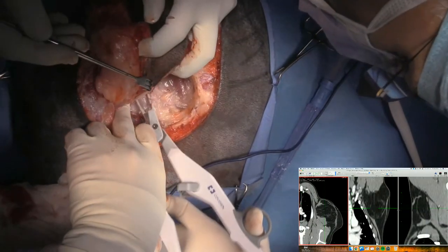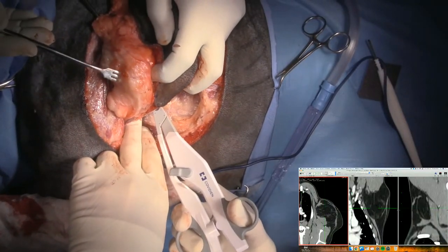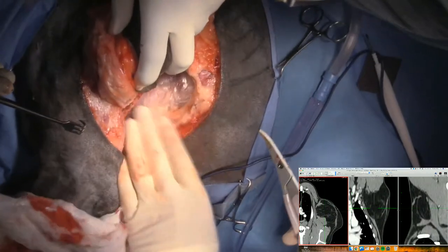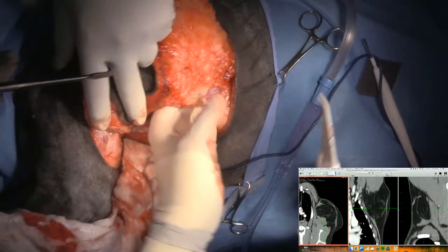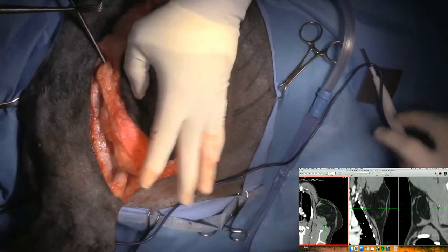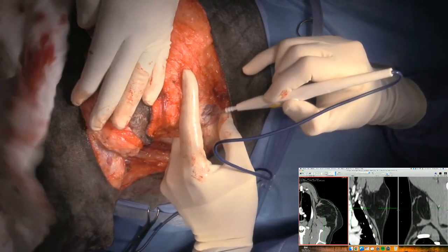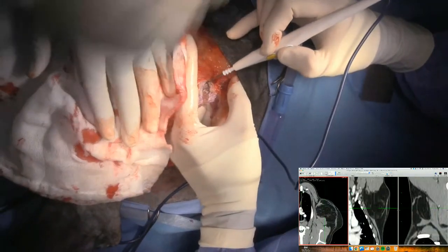So there's a question about how do you differentiate a normal lipoma from an infiltrative one? And on CT, it's pretty easy. Histopathologically, they can tell as well. If you've got lipoma invading into muscle fibers, then it's considered to be infiltrative. So I'm transecting the latissimus dorsi here.